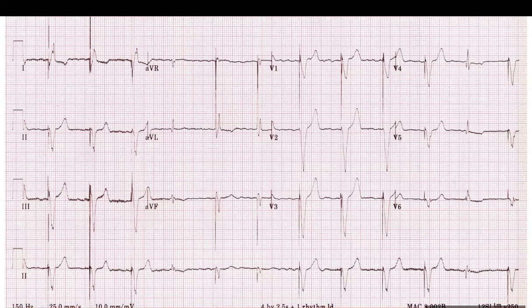So atrial activity, continue following the whole rhythm strip. Yes. You don't see an organized atrial activity, if you want to say that. If you follow the rhythm strip, you're going to see a lot of disorganized atrial activity. Yes. When I follow the rhythm strip, there is one single that is not paced and 2 that were paced with different morphology.